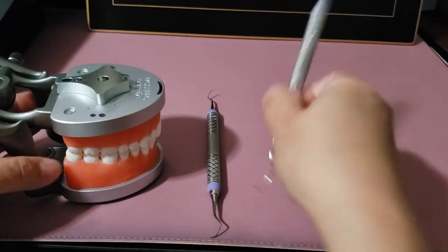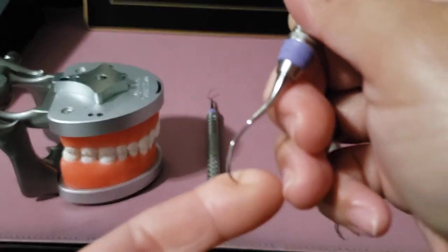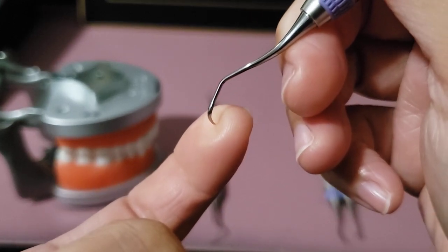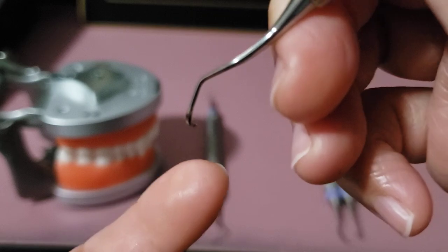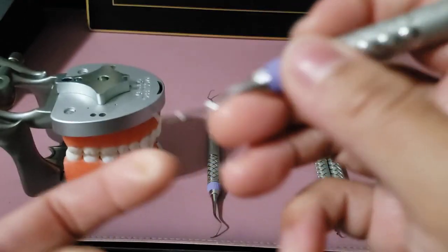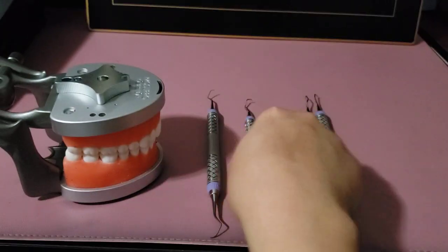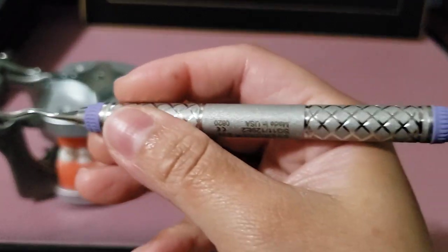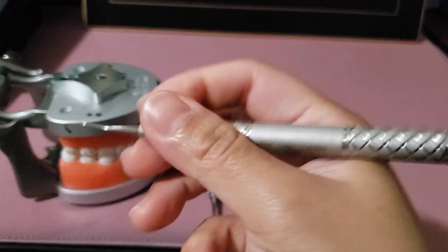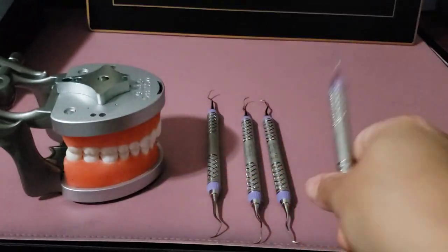For Gracey instruments, the face of the blade is 70 degrees to the terminal shank. Remember that only one side of the blade is activated — it is always the lowest side of the blade that is against the tooth. The 13-14 Gracey is only used for distal surfaces, the 11-12 Gracey is for buccal and mesial surfaces, and the 1-2 is only for anterior teeth.